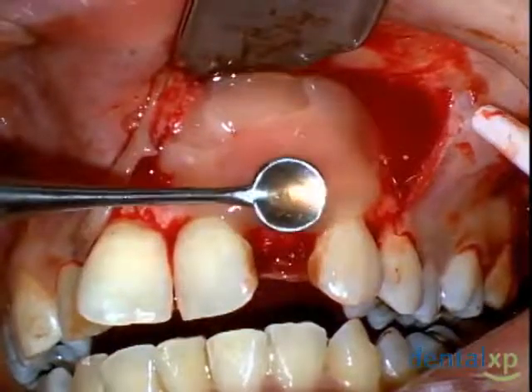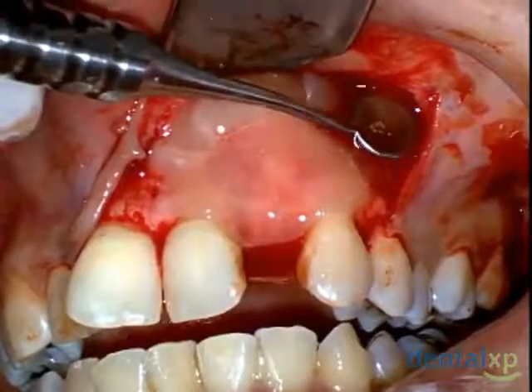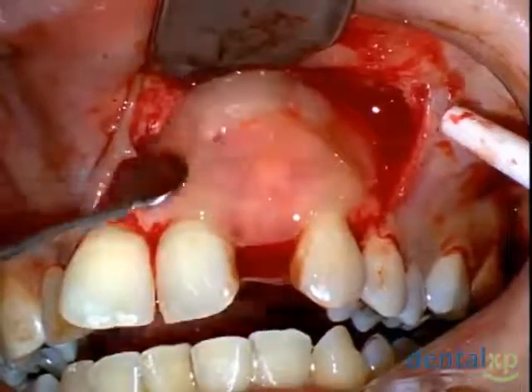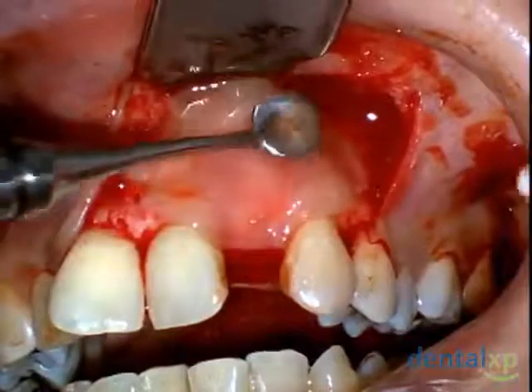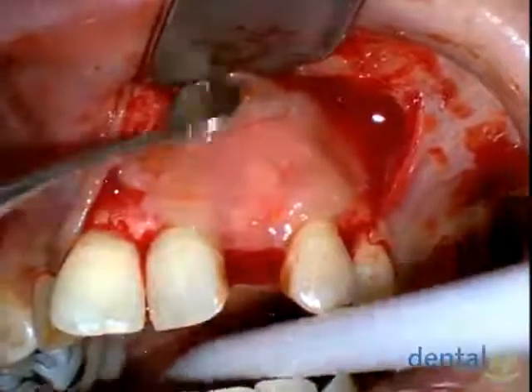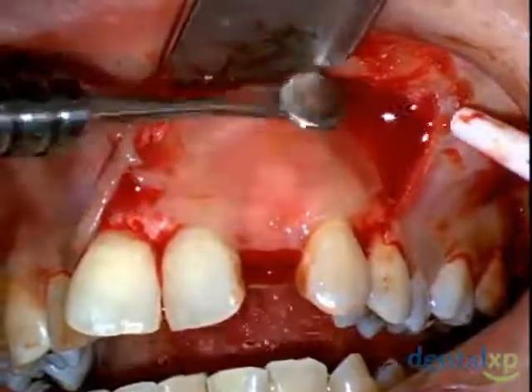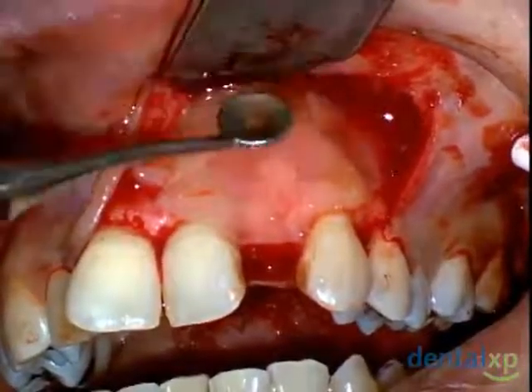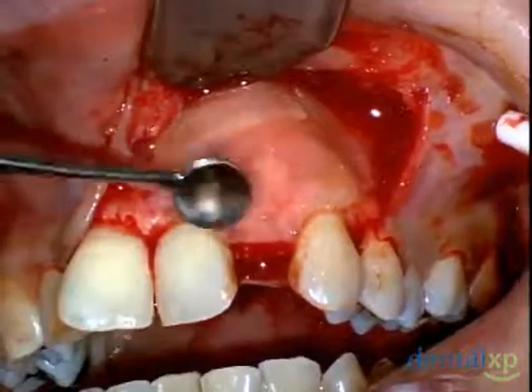And this material gives us about 2 to 3 minutes of working time before it starts to set, and it goes from a yellow color to a pale color when it starts to become more firm. So you can see us starting to adapt it around the Bio-Oss collagen. And this really allows us working time to really shape this and protect all of the bone graft that we have just placed into the area.